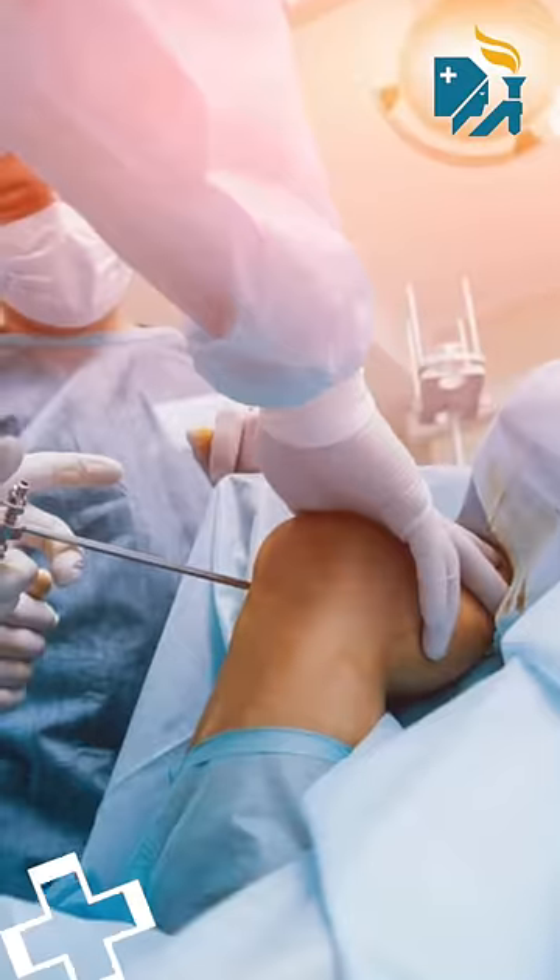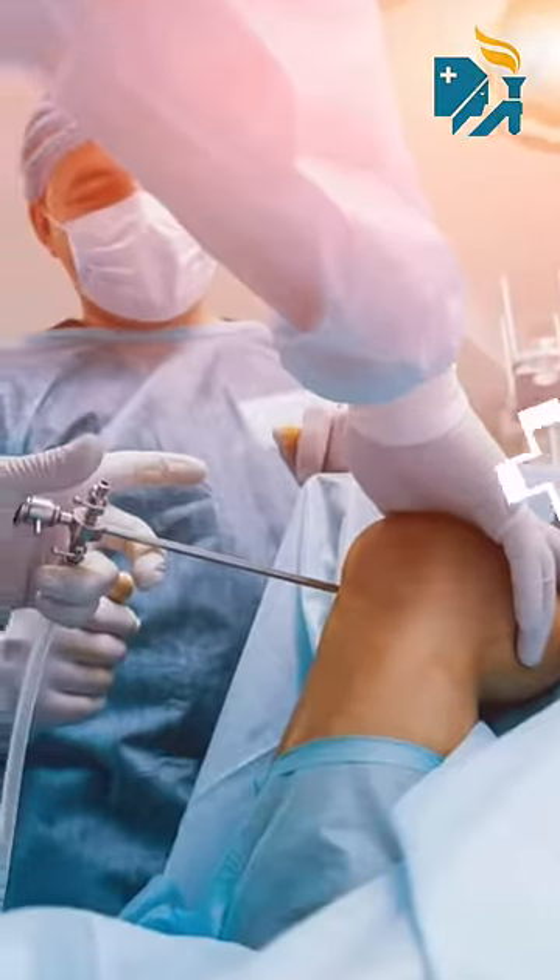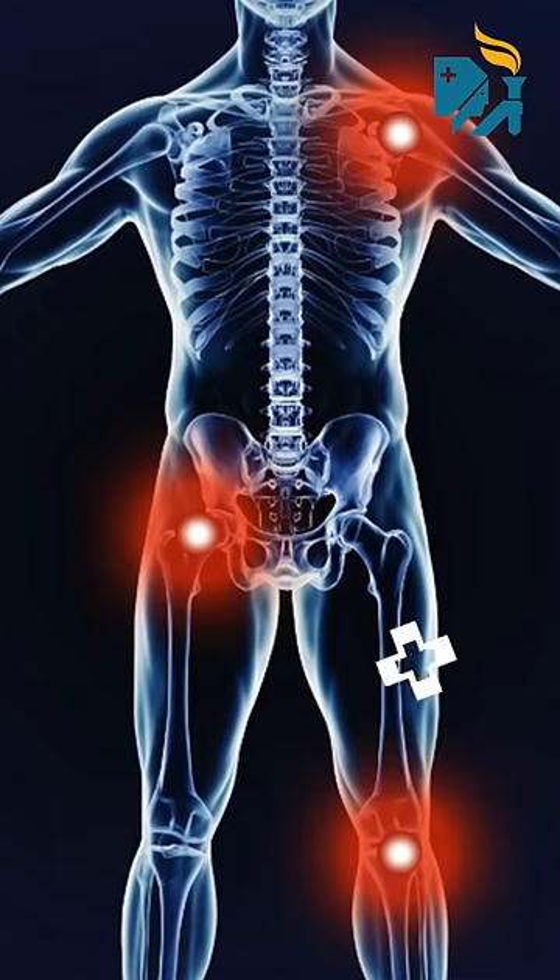Arthroscopy is a keyhole operation. We usually do it for hip, knee, and shoulder arthroscopy, but all other joints can also be addressed through this technique, like elbow and wrist.